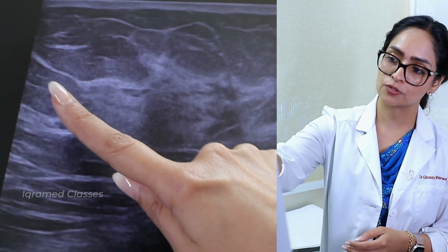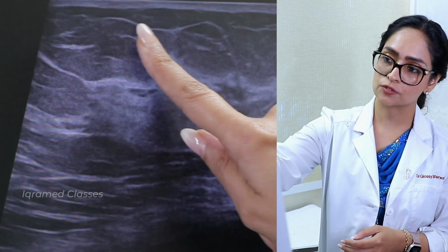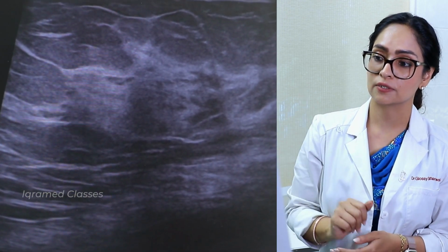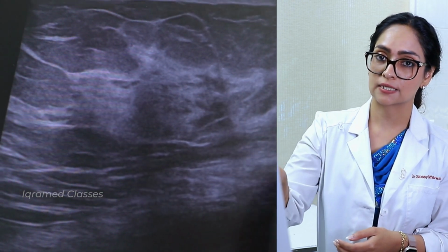Then comes the mammary zone. Now this is the mammary zone of the breast. So pre-mammary, mammary zone. In the mammary zone, what do we find? Where there is fibroglandular tissue. This is how the normal fibroglandular tissue looks like.